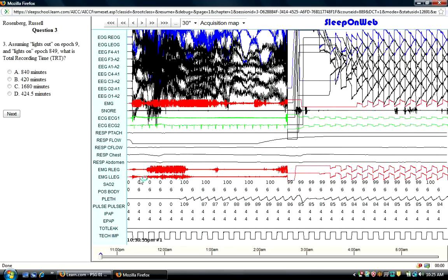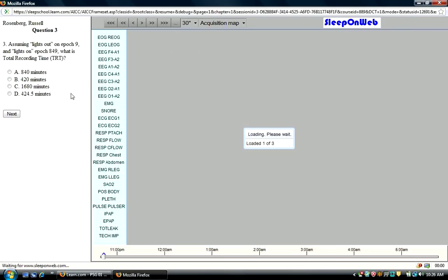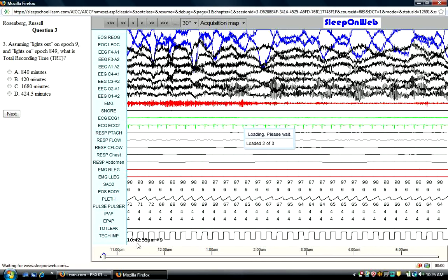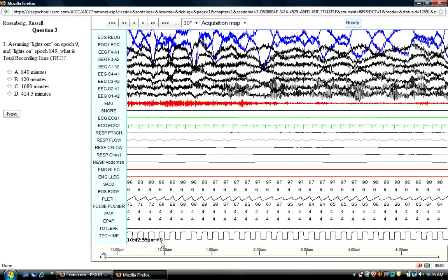You'll also find that the question will advance you to a place in the study that the answer is most apparent to you, or at least a good starting point for you to determine where the answer is. Don't forget in the lower left-hand corner you can determine the time of the study as well as the epic number.